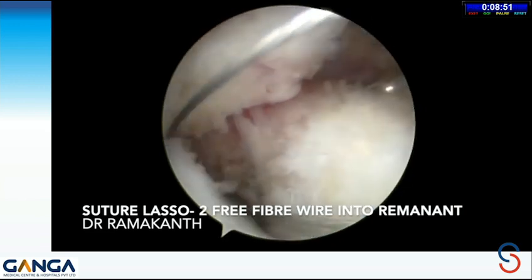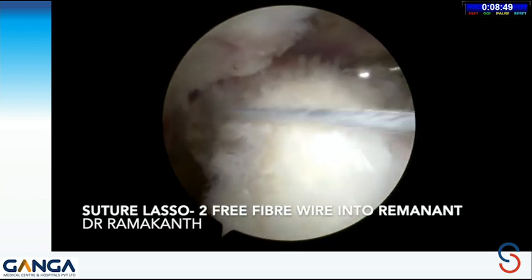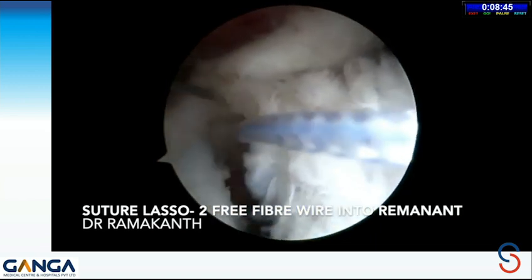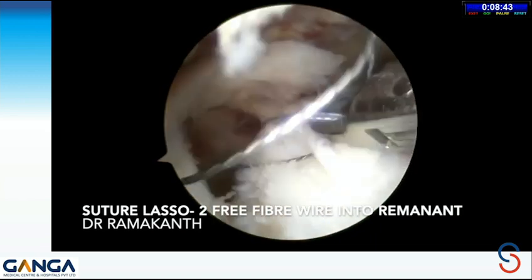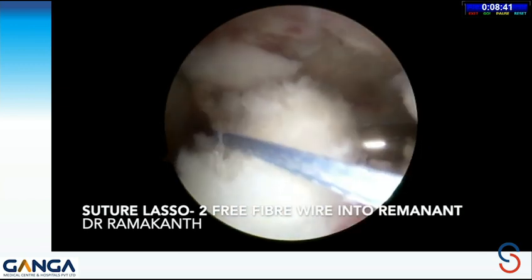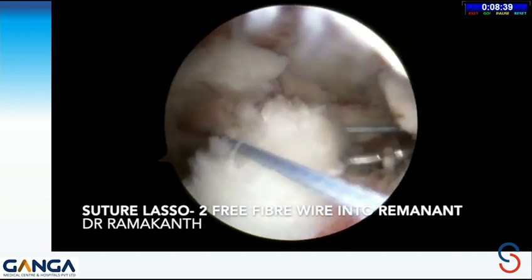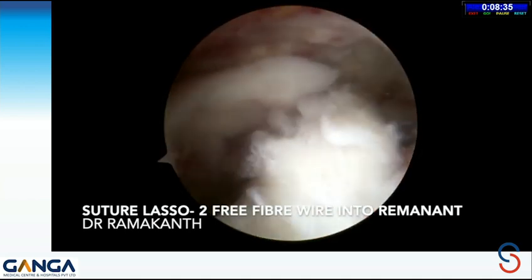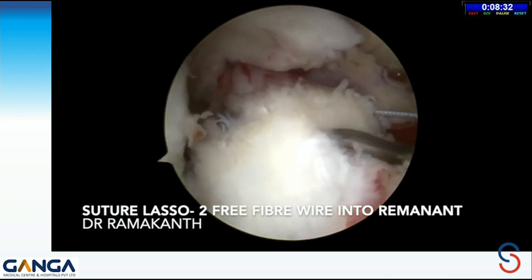With the suture lasso, a free fiber wire was taken into the distal, the lateral stump. Both the ends were taken into the stump, and it forms the loop within the stump, and then the same fiber wires can be taken to the medial stump as well.